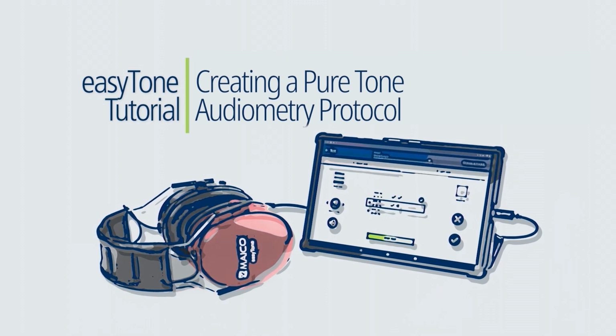This completes this tutorial on creating a pure tone audiometry protocol. Please continue through the tutorial series for additional easyTone instruction.